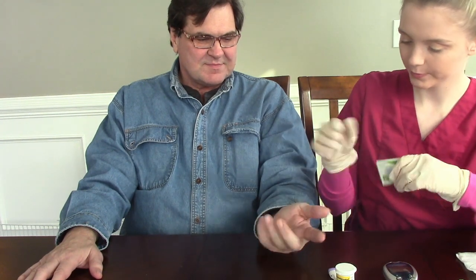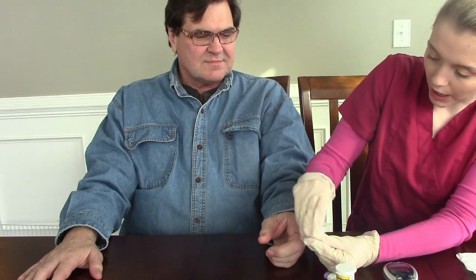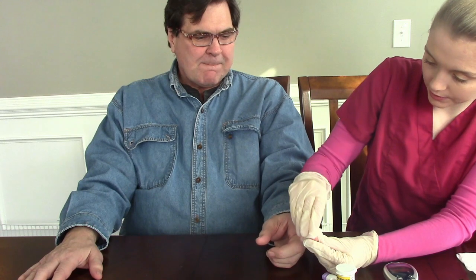The next thing we're going to do is pick a finger. Do you have any particular finger that you prefer? And we always want to do it on the side of the finger, never on the tip. We're going to take our alcohol wipe and wipe off the site. Never blow on the finger to get the alcohol to dry — just let it dry on its own.